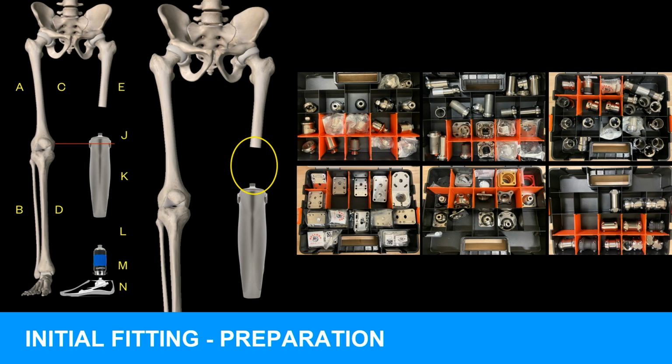So if you're going to be doing acute OI care, it's good to have every low-profile component available to you. Sometimes we do cohorts of 6 patients in one day, and I got to tell you, I know I'm getting old, but that's a lot of work to fit 6 patients in one day with OI when I have an hour and a half to fit within that small area.